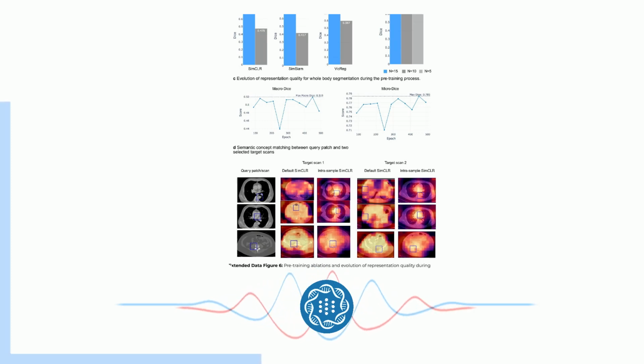Okay, I'm definitely seeing the potential here. But I'm curious, those other tasks you mentioned, like tumor identification and head CT triage, did those also benefit from this patch-based approach? They did, yeah. And it's important to remember that CTFM is a foundation model. So that means it's learning these general representations of anatomy that can then be adapted to all sorts of different tasks. Think of it like a really talented musician who can play multiple instruments because they have a really strong foundation in music theory. So the same underlying knowledge that helps it segment organs also helps it spot tumors and classify head CTs.